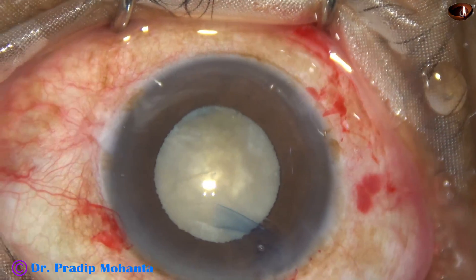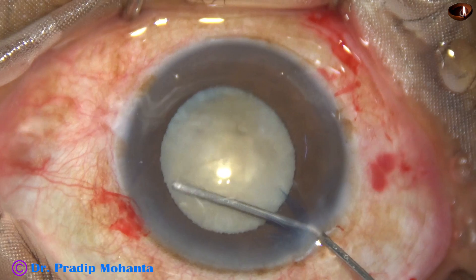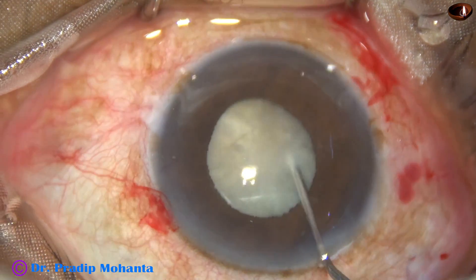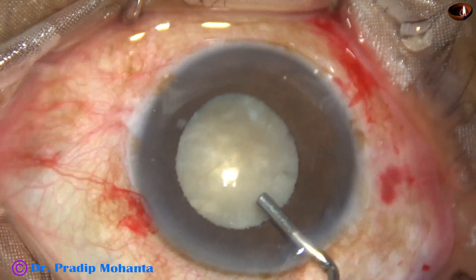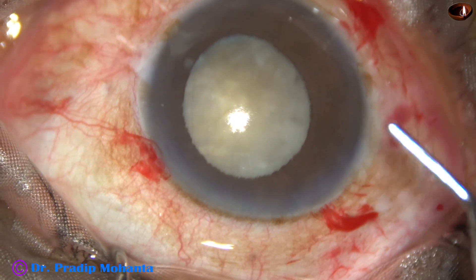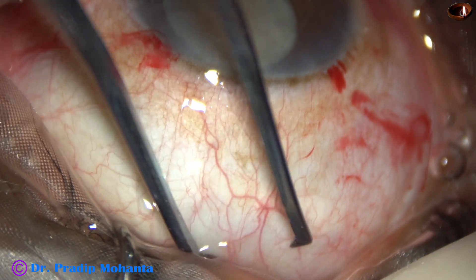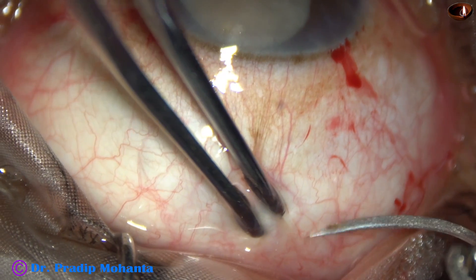Now I have a very weak area of the rhexis at 7 o'clock or 6:30 o'clock. As I do hydrodissection, I find that the pupil has become very small — about 3.5 mm. At this stage I decide not to do phacoemulsification in this case. I inject some more visco and decide to convert to small incision cataract surgery. I place a superior rectus bridal suture.